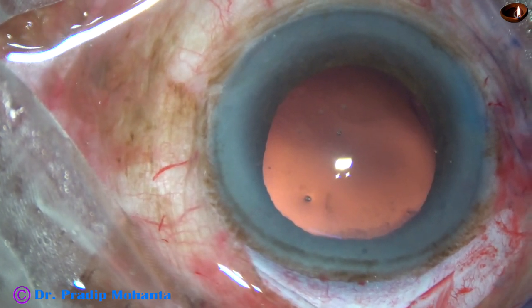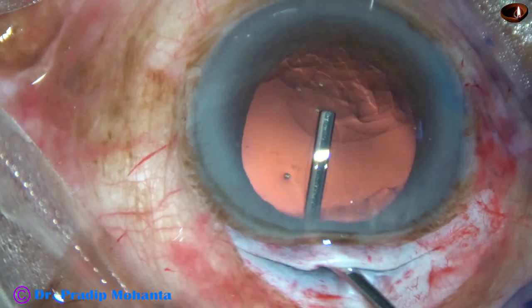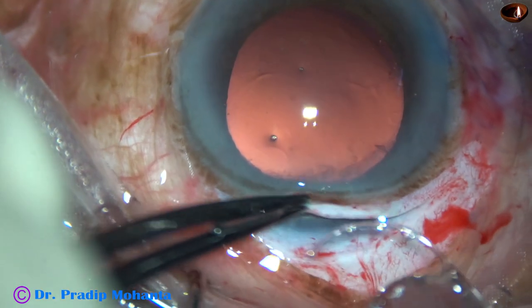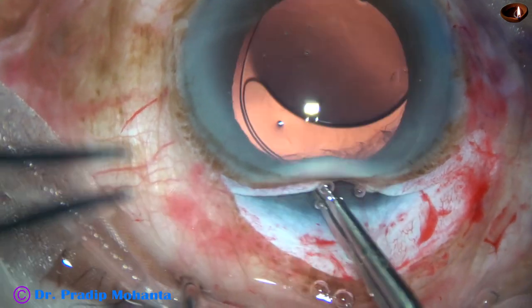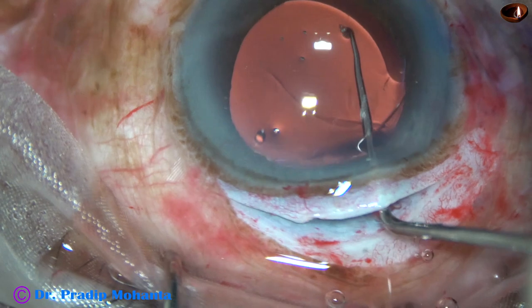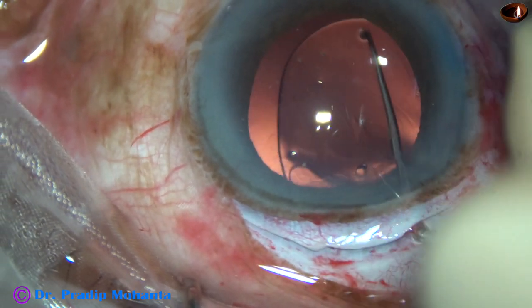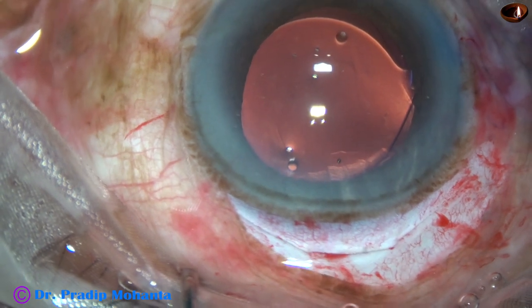And now is the time to implant an intraocular lens. The capsular bag as well as the anterior chamber is filled up with viscoelastic substance. A rigid lens is being implanted in this case — a rigid PMMA lens. It is a 6 mm optic lens with two dialing holes, though the dialing holes are actually not necessary; we can dial the lens by the haptic-optic junction. The lens is nicely in the capsular bag.